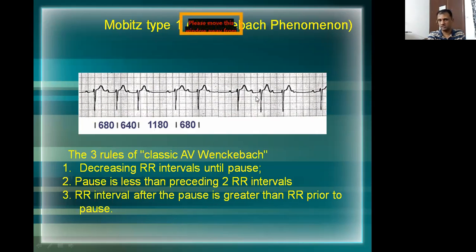After one of the beats is missing, it normalizes again. So it is kind of an intermittent conduction block. It's called Wenckebach's phenomenon.